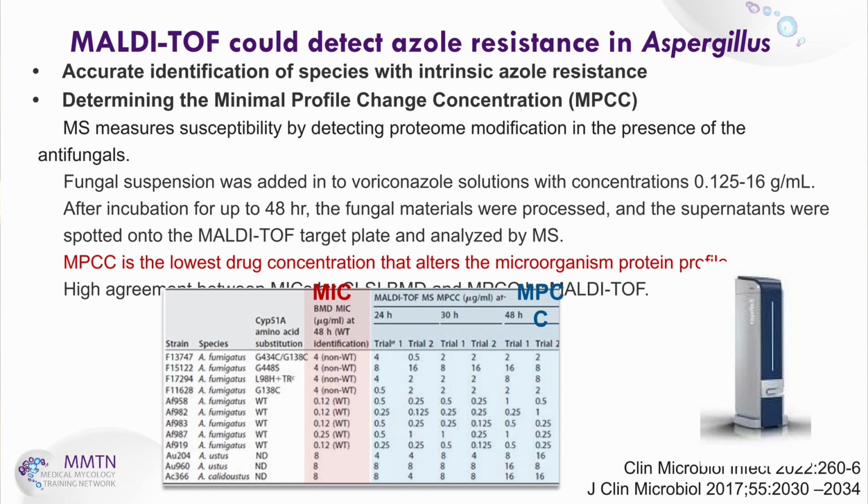Briefly, to determine MPCC, fungal suspension was added into voriconazole solutions of different concentrations. After incubation for up to 2 days, the fungal materials were processed and the supernatants were spotted onto the MALDI-TOF target plate. The protein profile of Aspergillus co-cultured with voriconazole was analyzed by MALDI-TOF.